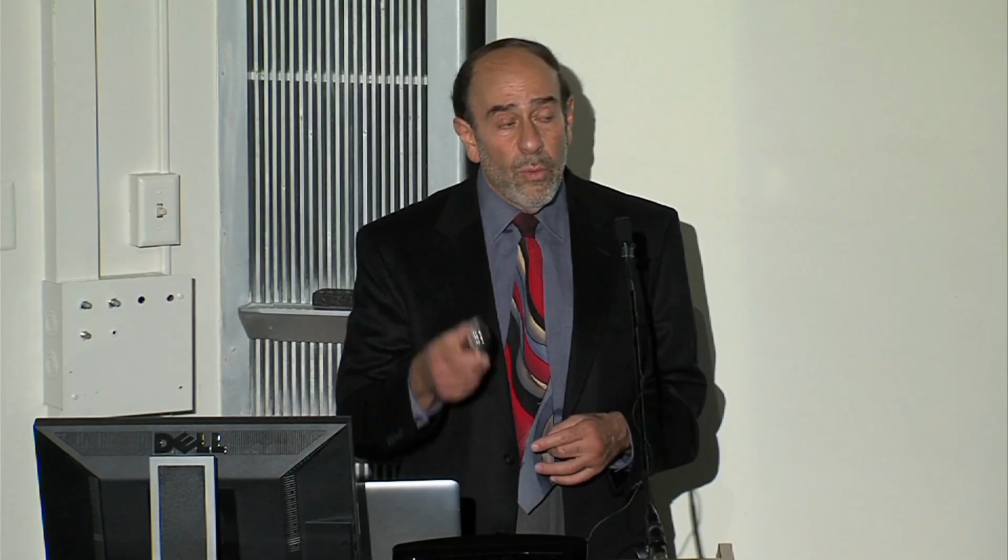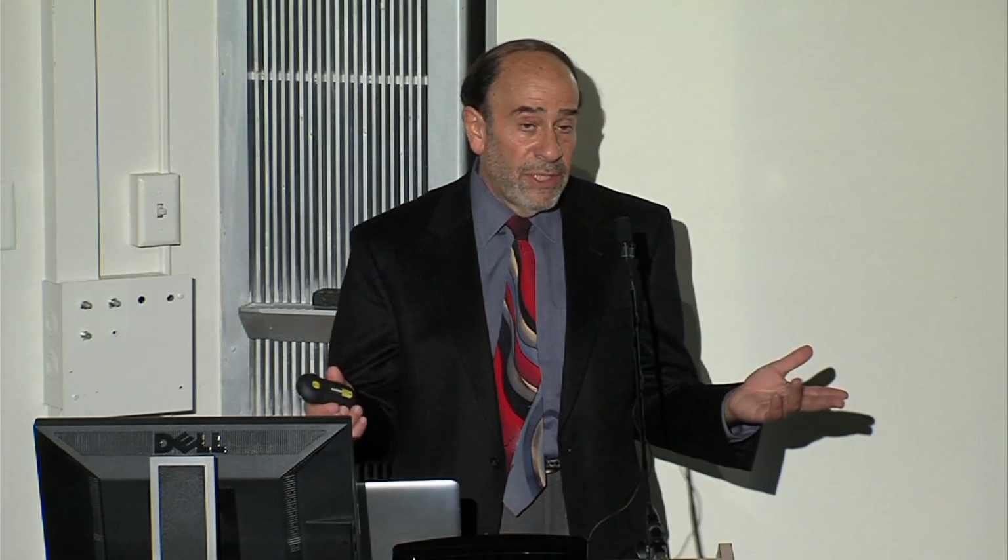I can read images from any other facility. The emergency department here on Parnassus, the outpatient facilities here on Parnassus, the inpatients, while reading also Mount Zion inpatients and outpatients, or from Mission Bay. And I do that every day. So it's an unbelievable step.